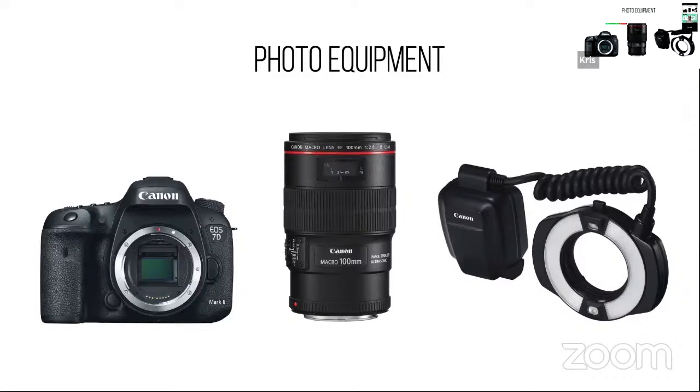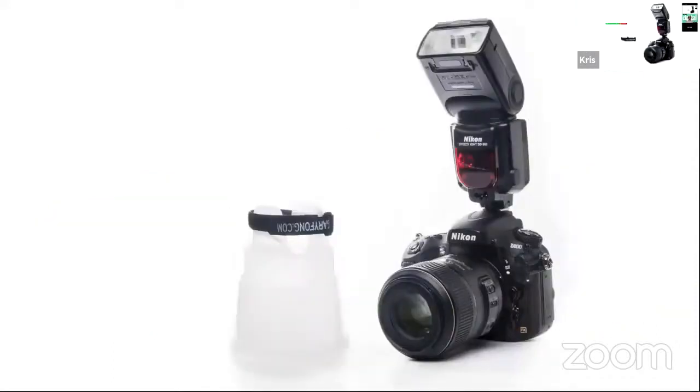Nevertheless, photo equipment for shots of the face could be exactly the same as you use for intraoral photography. So it means it's the same camera body, the same lens, which is a macro lens, and you can even use flash. However, the power which comes from the ring flash can be too weak to deliver good information about the face.